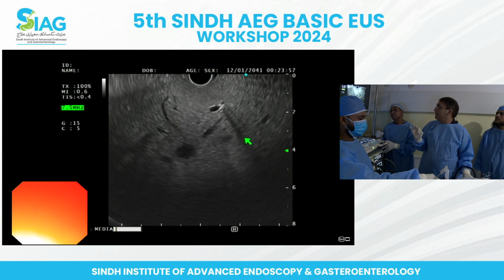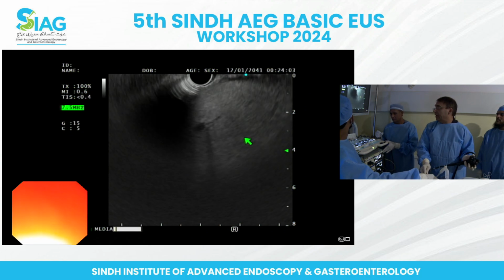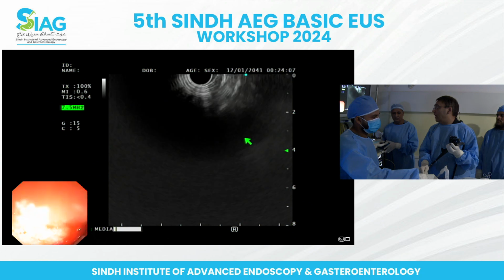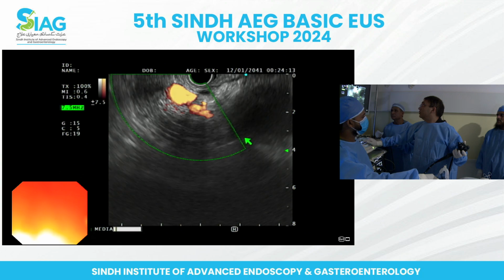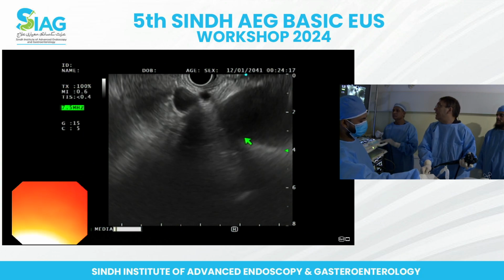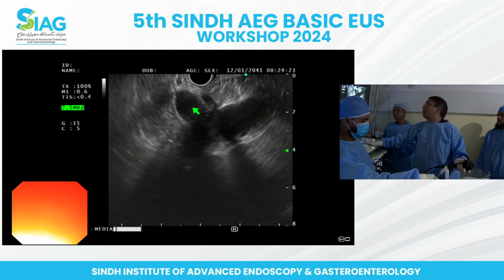Can we just ask you to go through the lobes on the right again? I mean, just from the branching of the left. Absolutely. So I'm going to come back. I will go into the duodenal bulb. Same way, we just got to find our portal vein. You see the portal vein? I will rotate my scope to the left to go towards the liver hilum. That's the liver hilum. You see the left portal vein, right portal vein.